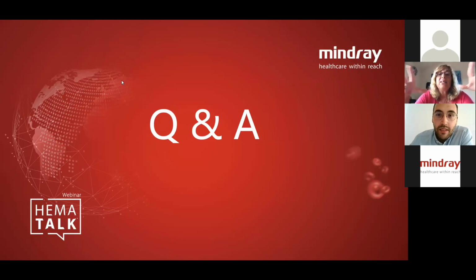I think that if you have an advanced hematology analyzer and an experienced morphologist, the work will be perfect. The combination. I think people working in morphology usually have protocols in our labs to standardize when we have to review.